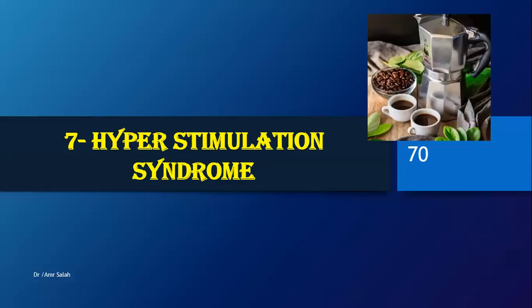Welcome to the fourth part of ovarian lesions, and today we're going to continue the ovarian lesions we're likely to see on ultrasound. We have talked before about the ovarian tumors. We have gone through how to diagnose the ovarian tumors and the PCO appearance and the PCO syndrome. Now we're going to talk about two other more confusing, similar entities.